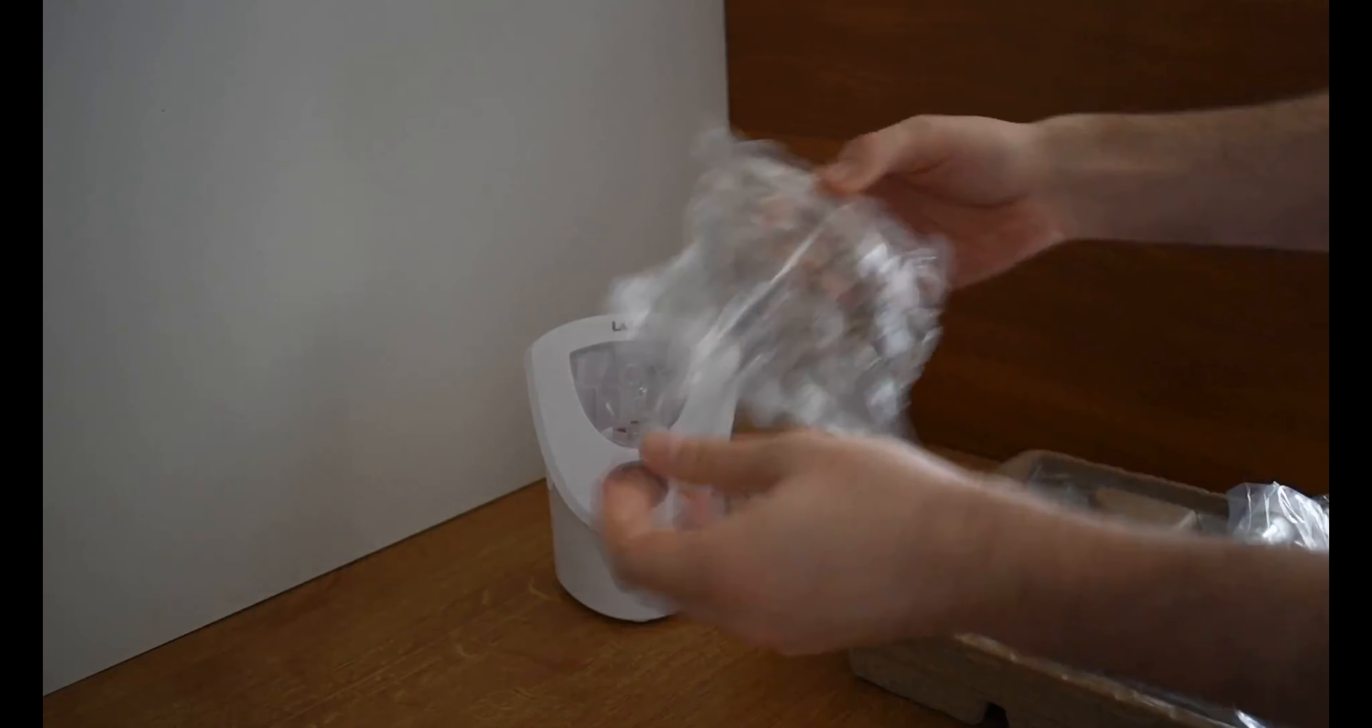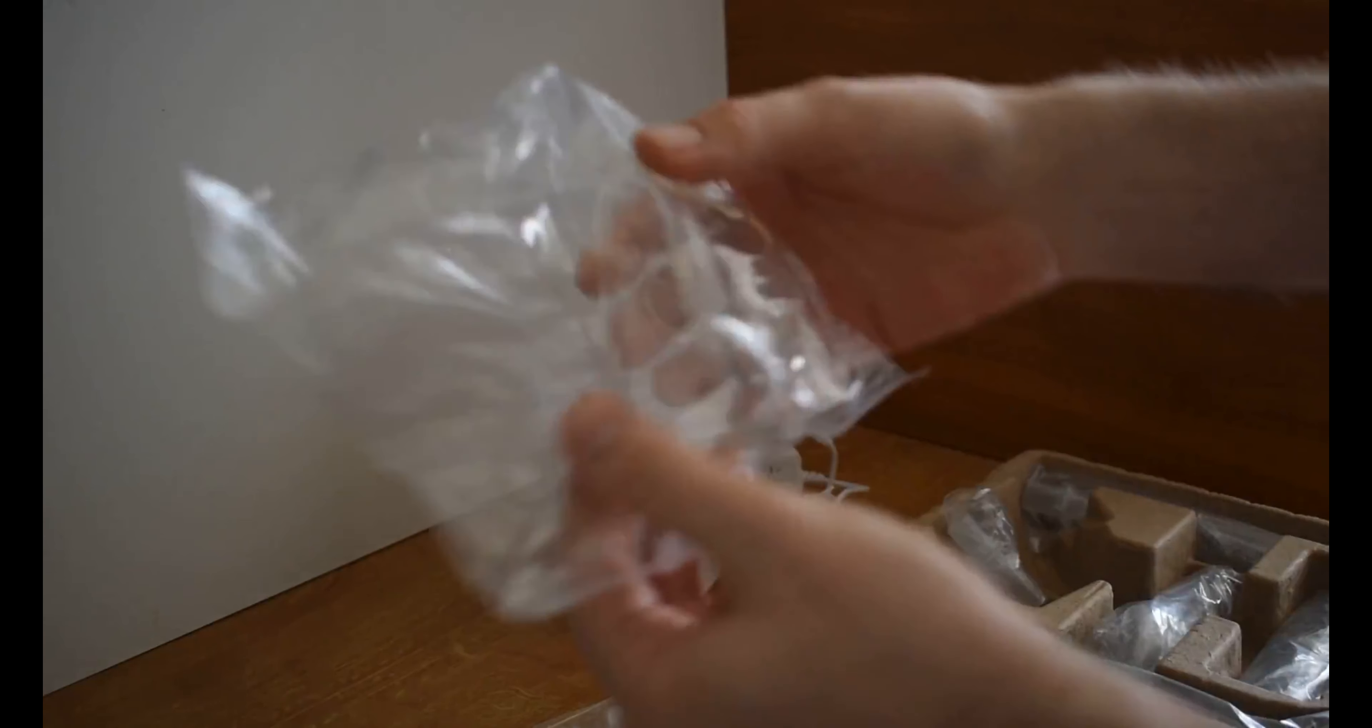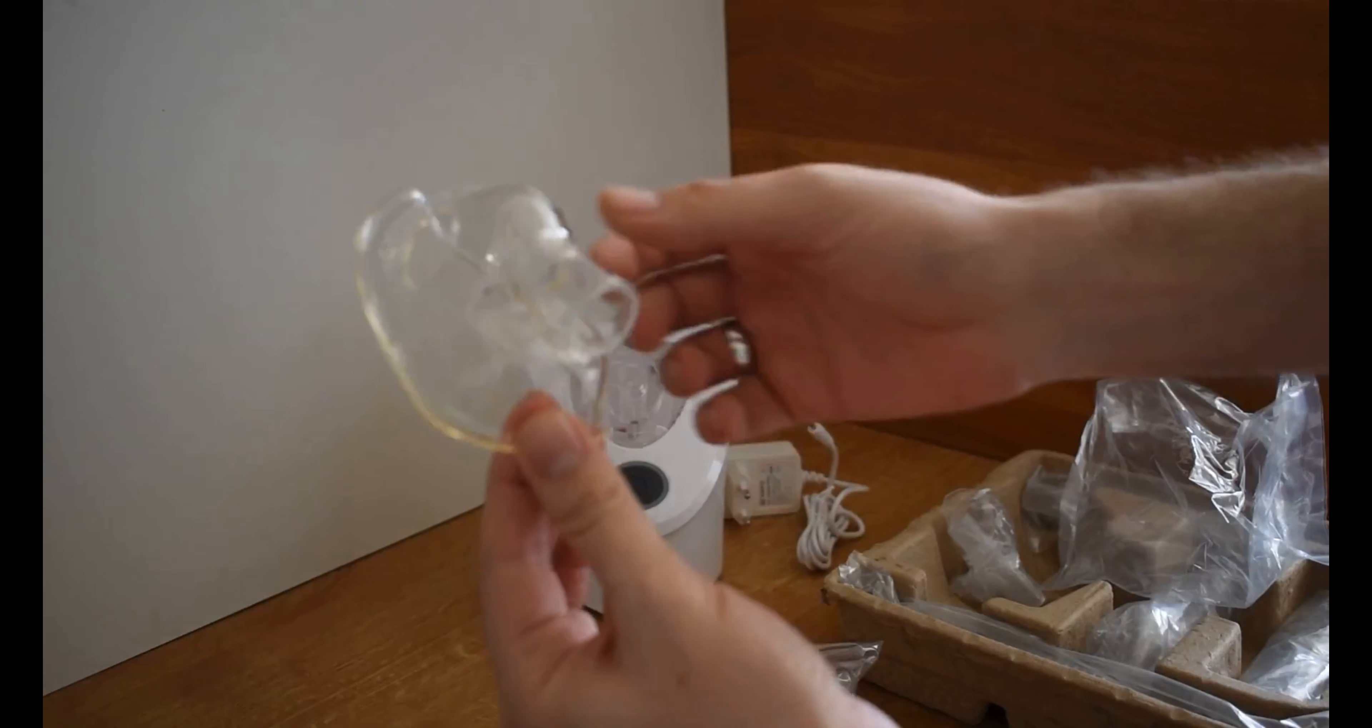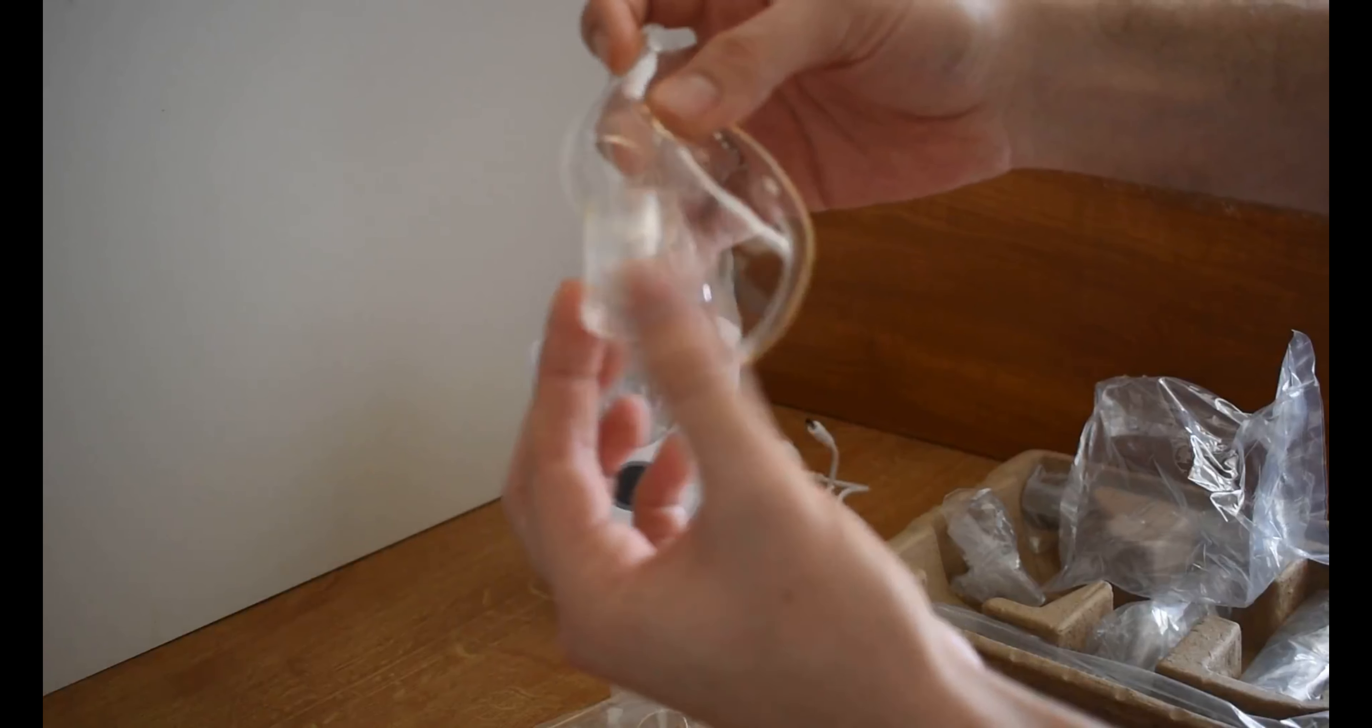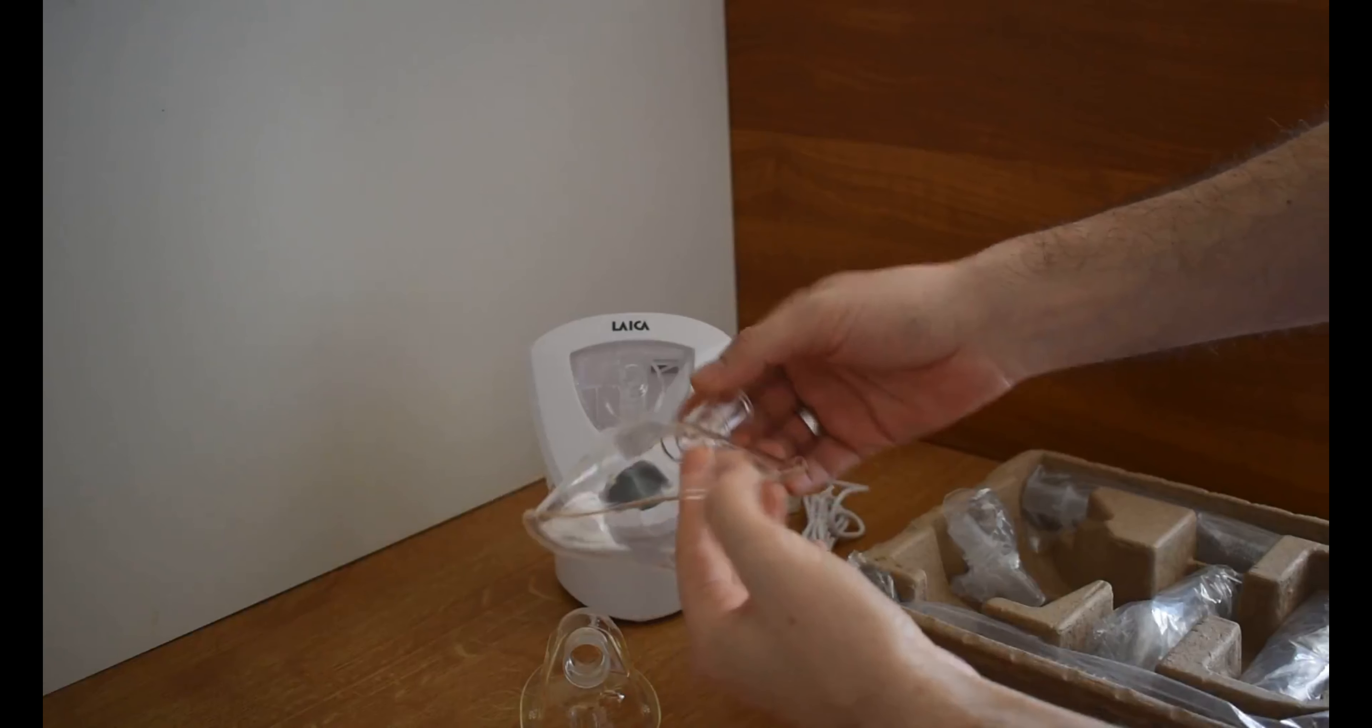Let's unpack first the adult mask and also the kids one. And here we have the children mask. It's soft plastic with a hard plastic on the tube connector part. It's the same for the adult one.